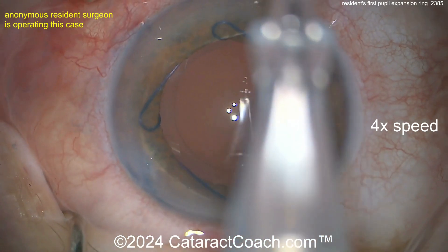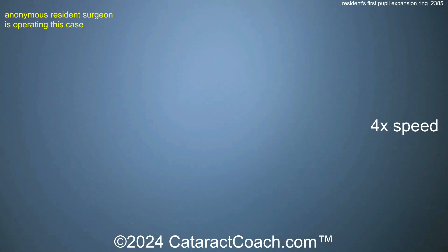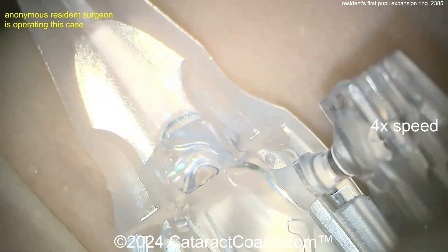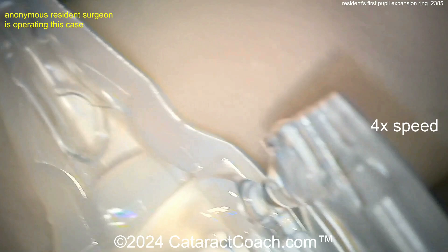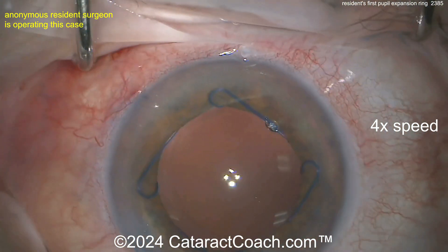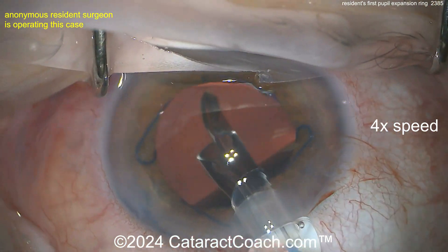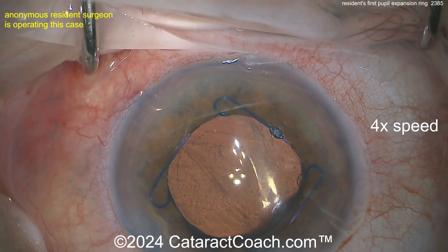Enlarging the incision — perhaps for a higher-power lens. There comes the lens; it looks like maybe it got stuck a little bit. This may be a high-power lens. Remember, these injectors don't always have the same size tip even with the same manufacturer, same lens, same brand — that's because a very thick lens like a 30-diopter lens is going to need a slightly bigger tip than a 20-diopter or 10-diopter lens. There's the lens in the capsule bag.